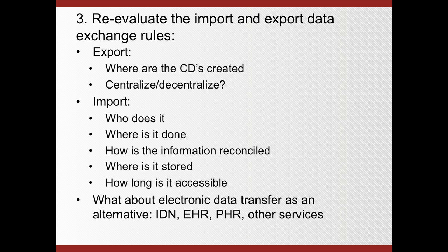But obviously you also want to make sure that you can connect with the electronic health records and the personal health records and other services as well. There are actually commercial services that you can engage and use as a temporary data transfer service, and they take care of the secure exchange, so to speak, almost like a post office or a mail service for your images.